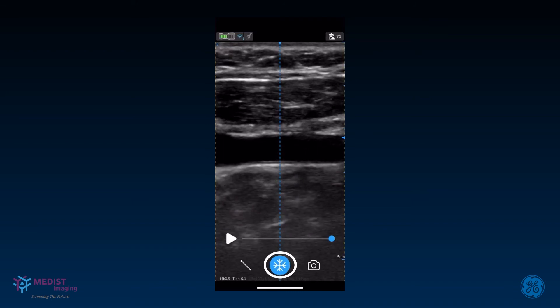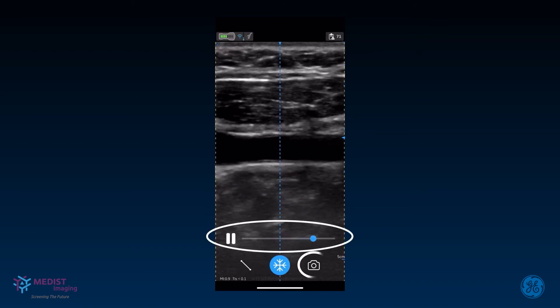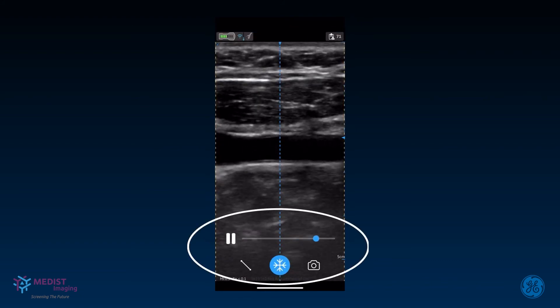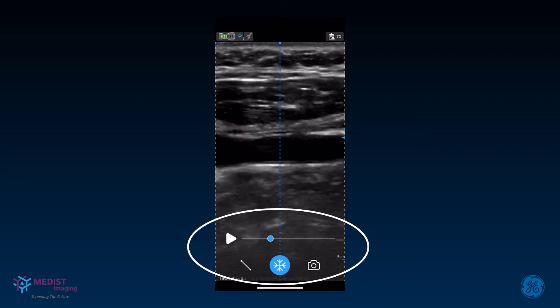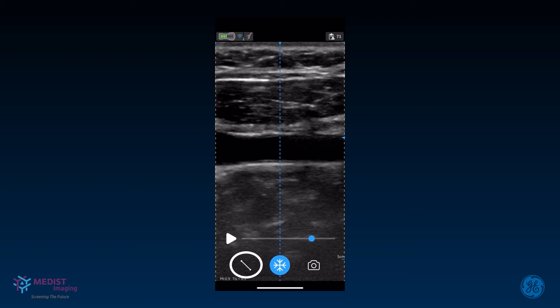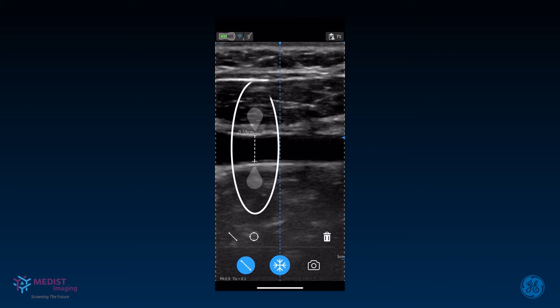Alternatively, to store a video, freeze, play the clip in the buffer, and press store. The scroll bar in freeze mode allows you to choose the desired frame in the buffer for saving or measuring. Move the slider to select a frame. vScan Air supports distance and ellipse measurements. Press Measure to activate measurement mode and move the calipers to position on the structure to be measured. Up to four distance measurements can be performed on a single image. To delete a measurement, tap on the caliper to select it and then press Delete. Distance measurement calipers are activated by default.